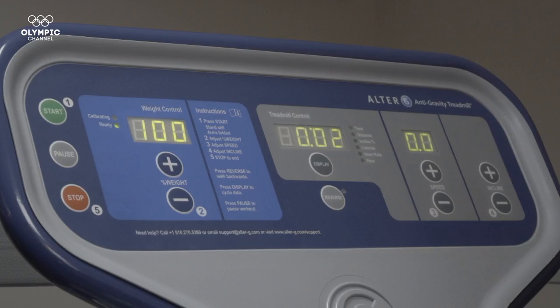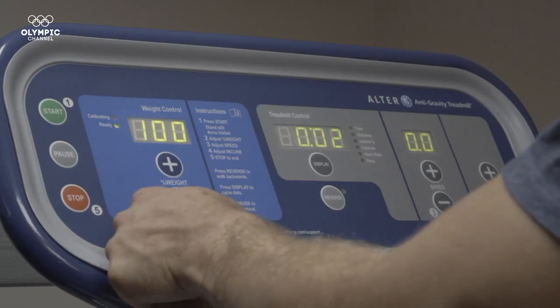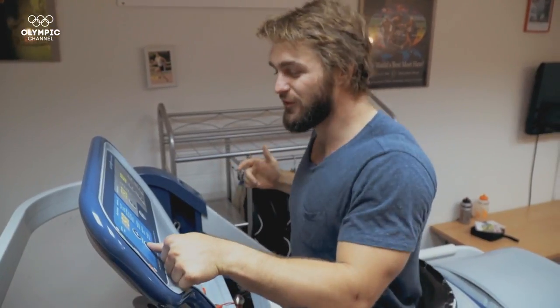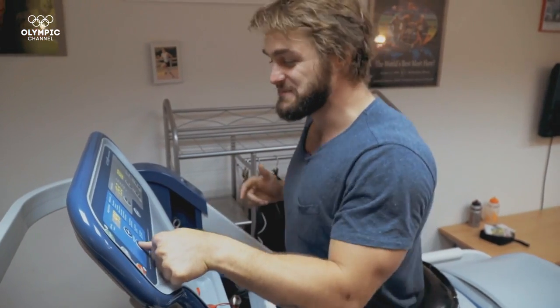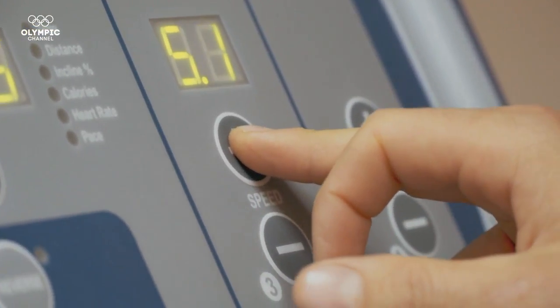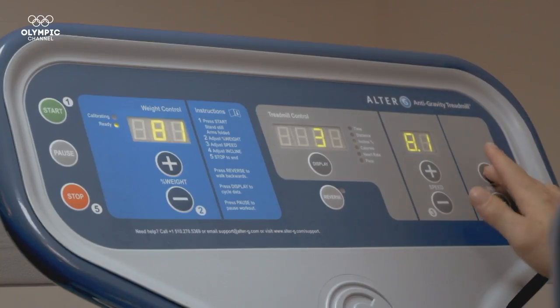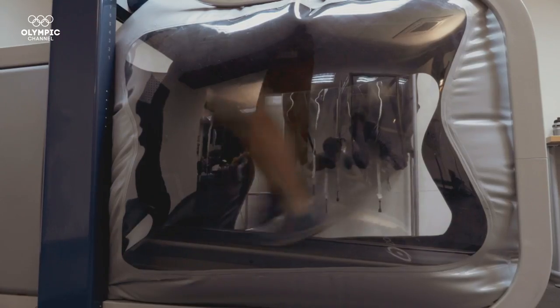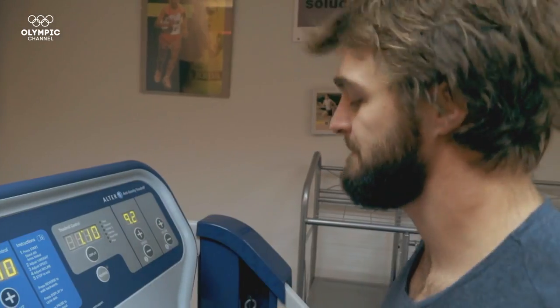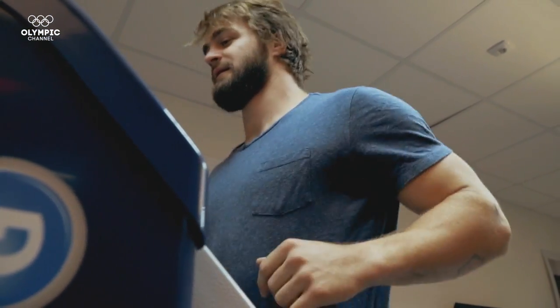The treadmill's display panel has three variable controls. The first allows the person to decide the percentage of weight they want to bear in a given moment — going all the way down to 20% of body weight, which means weighing 20 kilos, with feet barely touching the ground. The second variable control is speed, enabling the user to reach up to 12 miles per hour. Incline is the third variable control, reaching a maximum 15%; users can gradually adjust inclination to reach optimal performance conditions. Combining these three variables with precision and accuracy tailors an ideal healing and training environment for athletes.